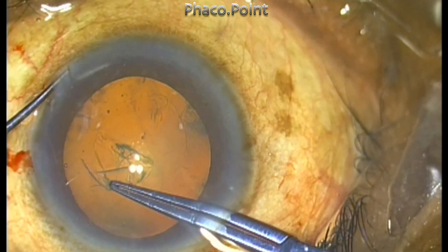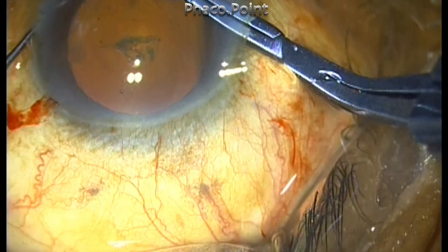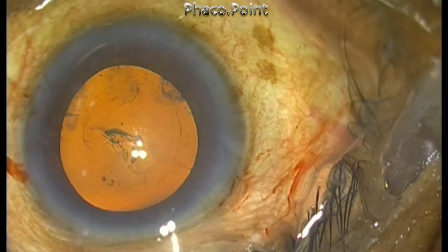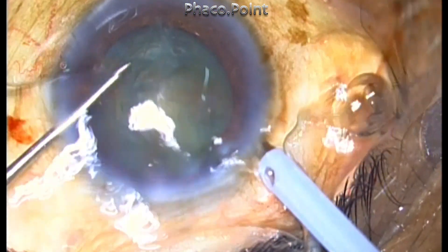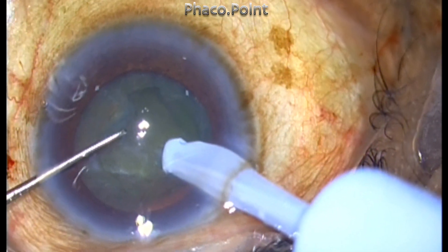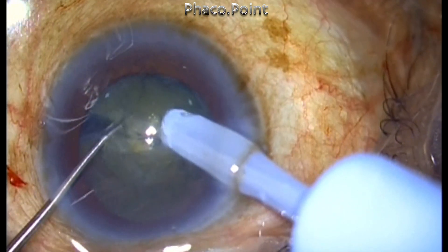This can help you in certain situations where you encounter a non-rotating nuclear fragment, or in cases of weak zonules where you are a little apprehensive about rotating the fragments. Now let us see the FACO emulsification in progress. I am performing the direct FACO chop — this is a grade 2 nucleus sclerotic cataract and the FACO power I'm using is around 30%.